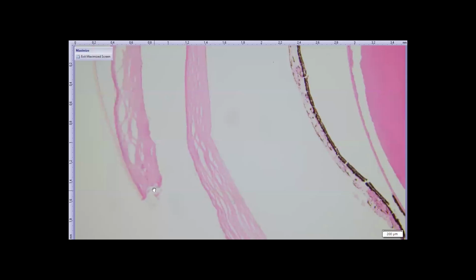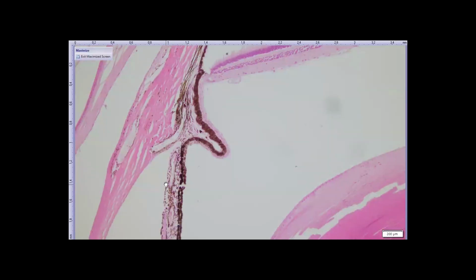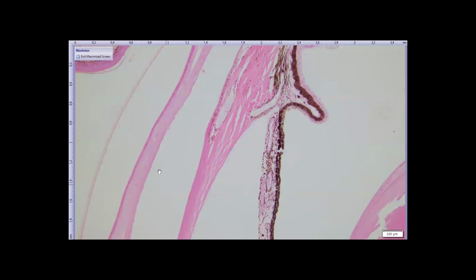So here's the surgical site. There was no time for any cellular reaction to occur. So everything is as you'd expect it to be in the native eye, except that there's this surgically induced defect. Now, the spectacle in a snake has blood vessels. You can see blood vessels here. So nutrients can go.